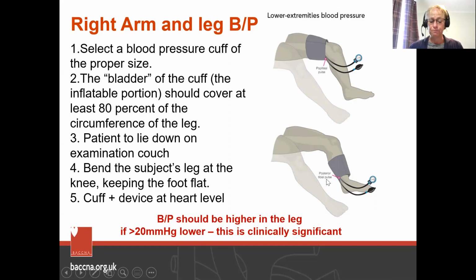It's important to warn the patient that the cuff can feel quite uncomfortable when it's inflated on the lower limb, just to make them aware so that they can try and stay calm during the procedure. And it's important to record the blood pressure accurately, and you're going to need to identify which limb you've done the blood pressure in. So a right arm and a right leg blood pressure are useful.